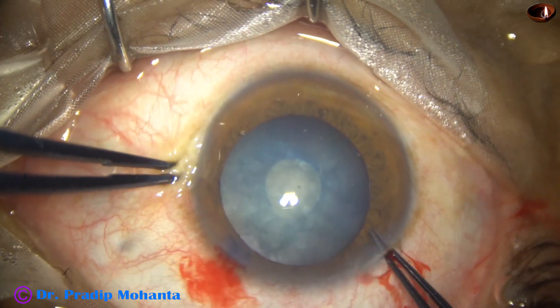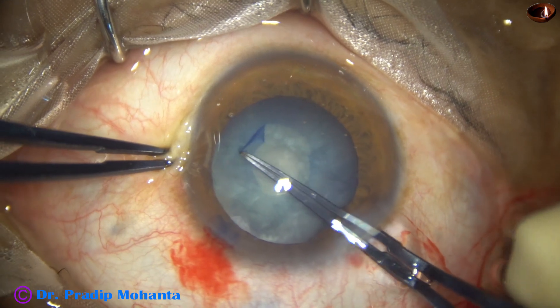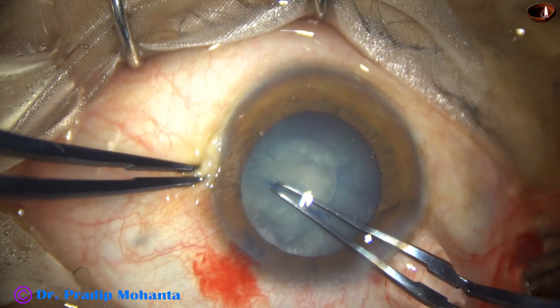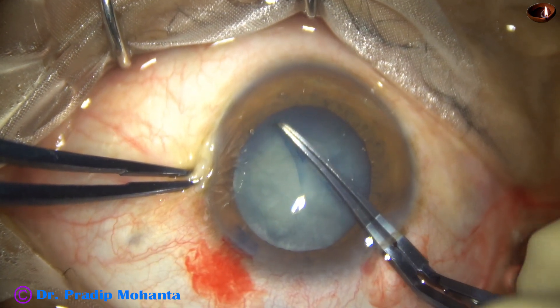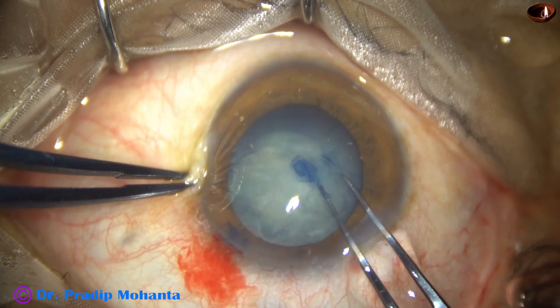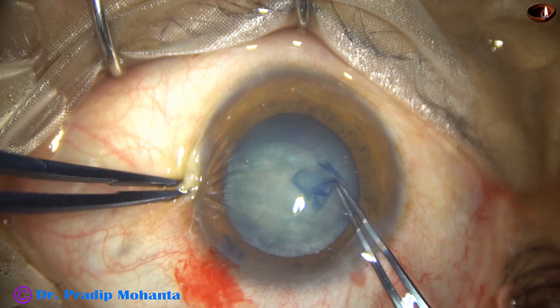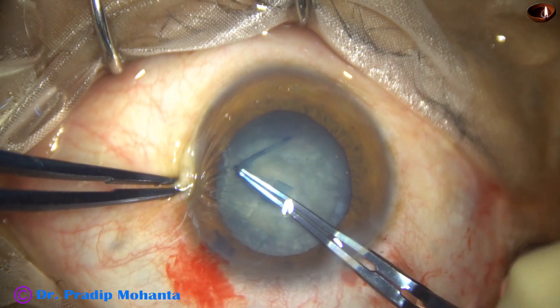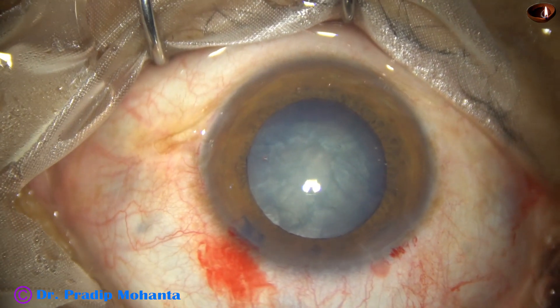An ink mark has been made at the margin of the small rhexis and now the rhexis is being enlarged. I am still making a small rhexis because I am afraid of rhexis runout in this case. The cataract is soft, and a small rhexis has been done. The size of this rhexis is about 4.5 mm.